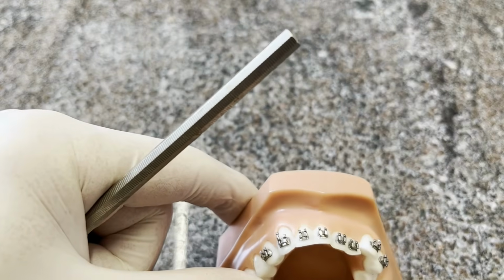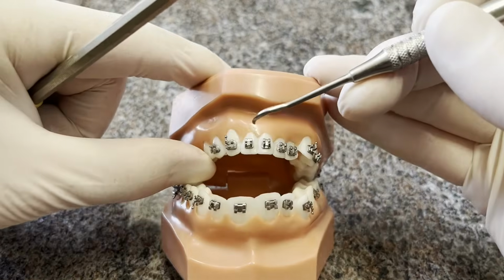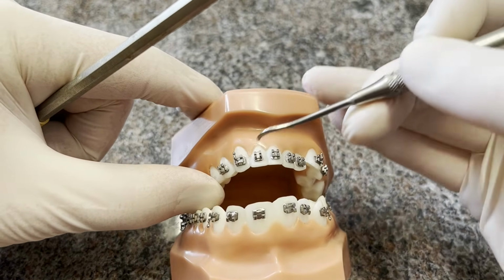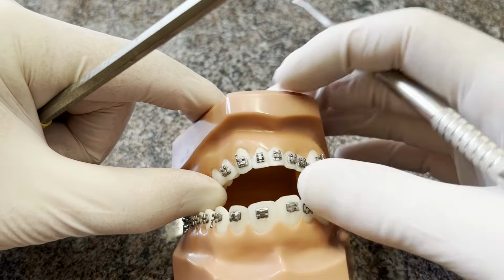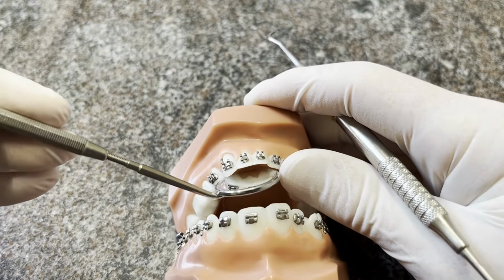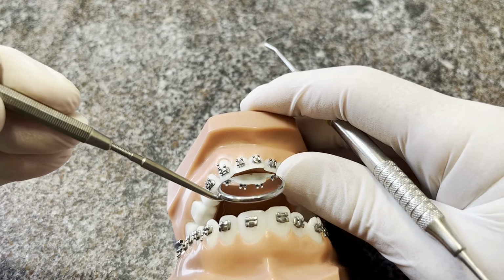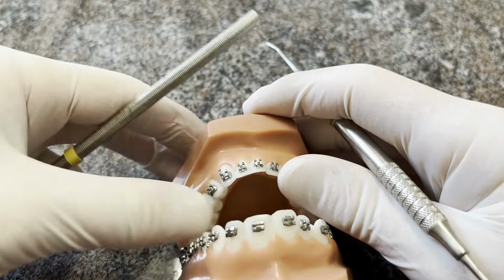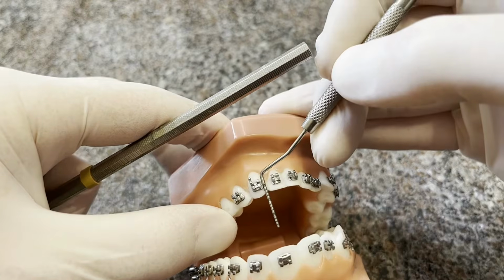Then you go on to the 2. You put the 2 on, get your height right after you set it on there. You'll get your tip about what you think it should be, and then these, you can't really look down the edge with your eyes, so what you'll do is check them in your mirror like this. And you want to make sure that the slot of that bracket is parallel to the incisal edge. And then you'll check the height of the canine like this.